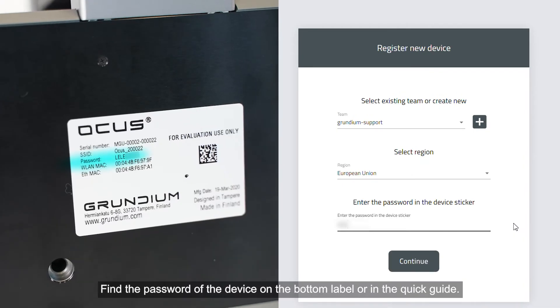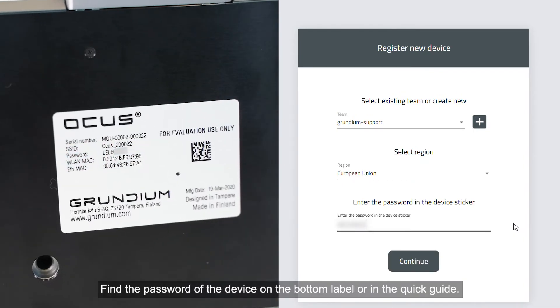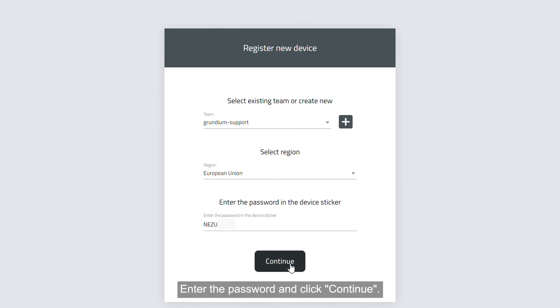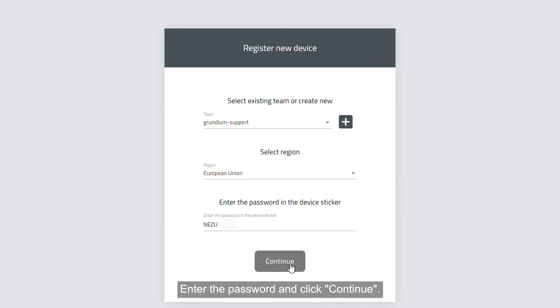Find the password of the device on the bottom label or in the Quick Guide. Enter the password and click Continue.